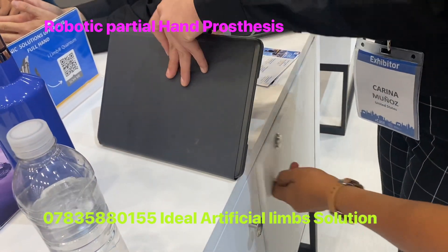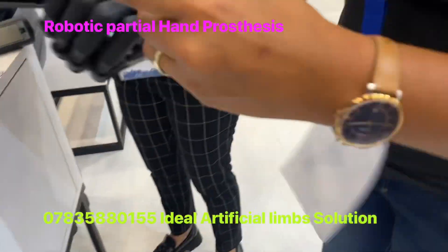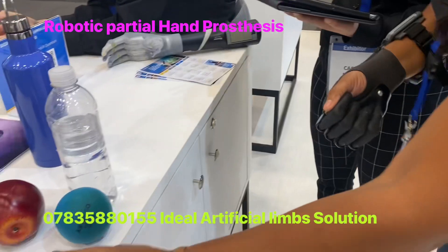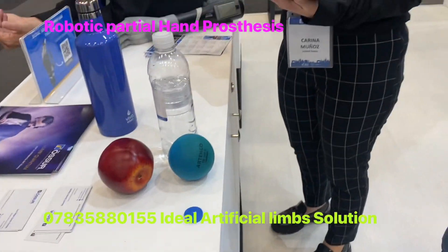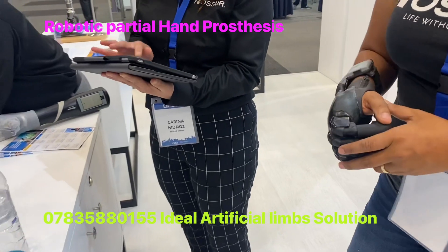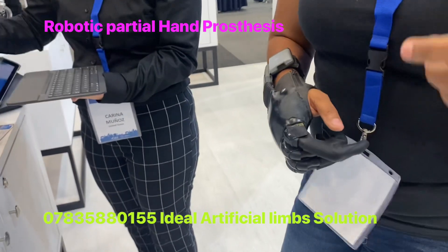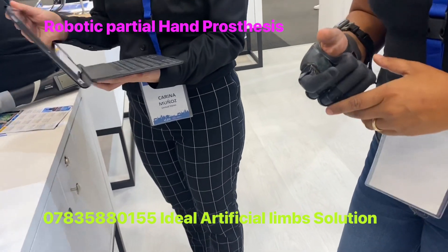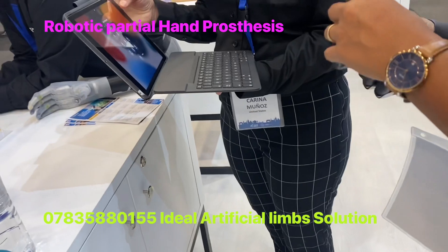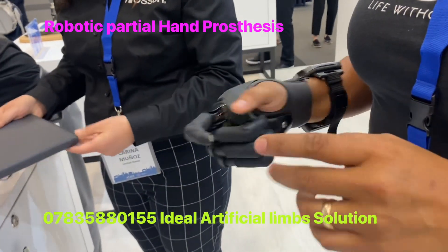We have these chips here. If you have somebody, you can configure it with a position — this is a grip chip. You put two tasks and it configures and gives you the exact shape. Like if you are in the kitchen, if you are driving, or if you want to work on your PC or other things.